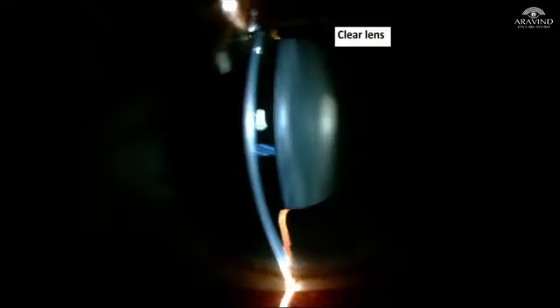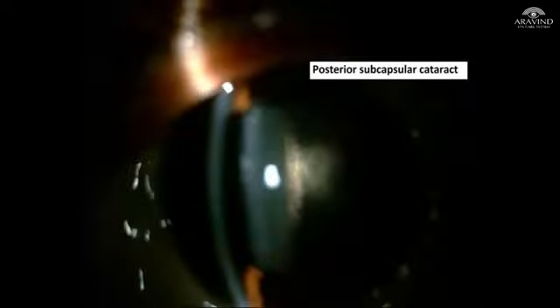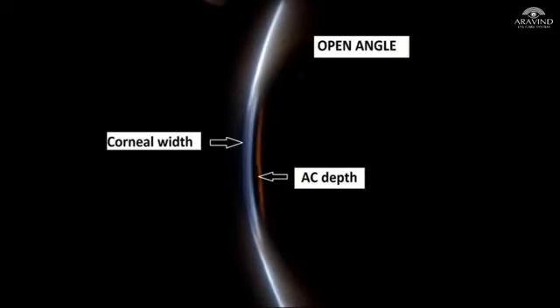The optical section on the lens is used to find the type as well as the grade of cataract. Clear lens, nuclear sclerosis grade 2, nuclear sclerosis grade 3, grade 4 or brown cataract, posterior subcapsular cataract. Principle of optic section is also used in Van Herick's grading for assessment of the depth of anterior chamber, and narrow slit is focused at limbus to compare the width of the cornea to the dark section between the cornea and the iris. When the anterior chamber depth is less than 1/4 of the corneal width, it is named shallow.